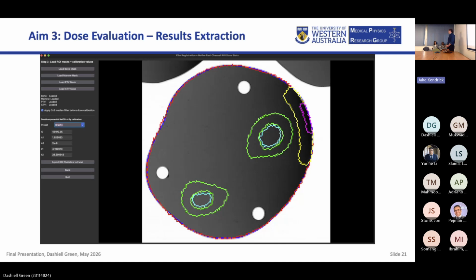No, it wasn't actually. We had a quick look between Film Wizard and mine, and I think we did one graph and the net OD versus dose looked pretty similar, quite well aligned. I mean, it wasn't a proper verification. It was like an eye test, but they looked relatively similar actually. In terms of absolute dose as well? No, we didn't use the Film Wizard analysis software for that. It was just the calibration.